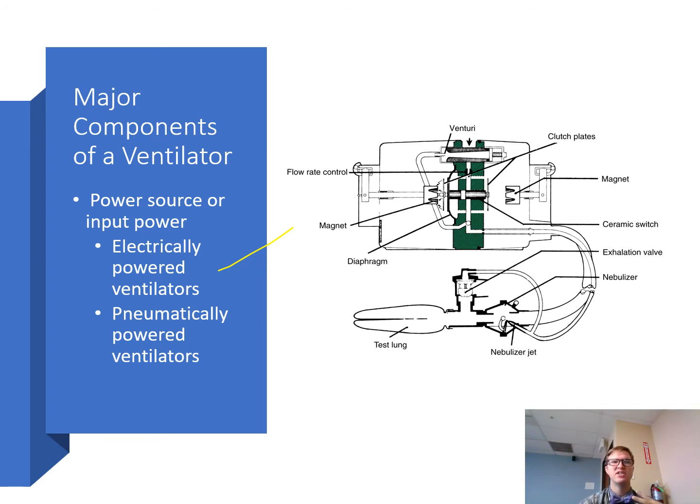Most current generation intensive care unit ventilators are typically pneumatically powered devices, right? I repeated that on purpose. The machine uses a 50 psi gas source with a built-in internal reducing valve, so the operating pressure is lower than the source pressure.